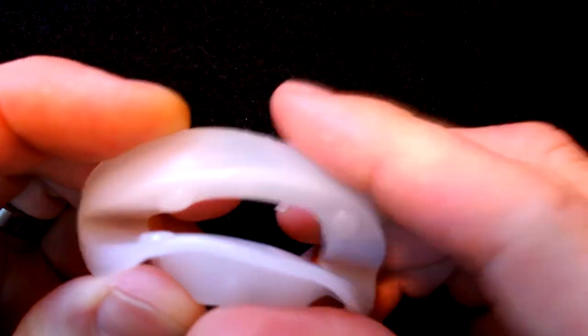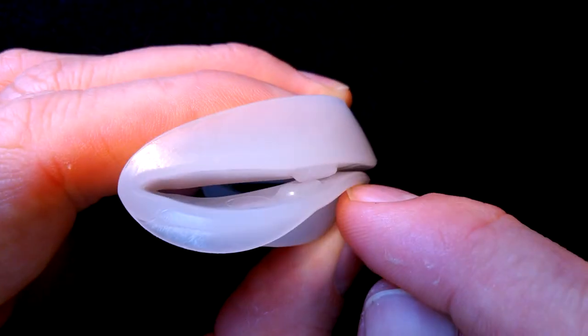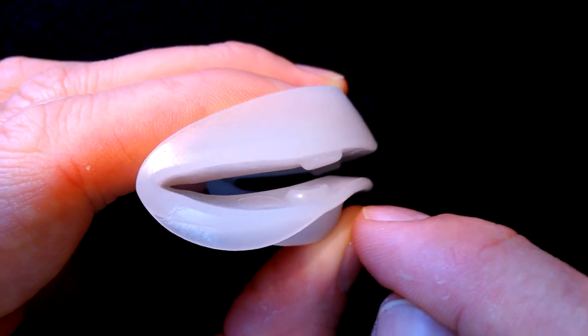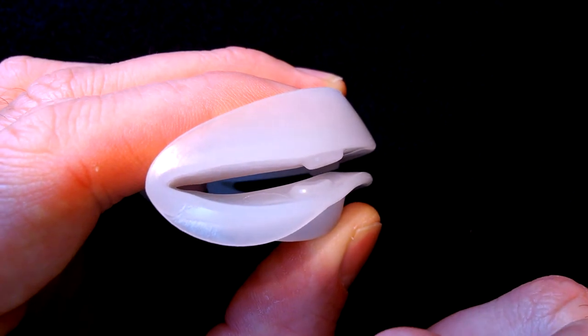This is the Snorermender, it's a mandibular advancement device, so instead of actually holding the tongue forward, it's going to hold the jaw forward, and that's going to tighten the airway and all the surrounding muscles, and that's going to prevent snoring.